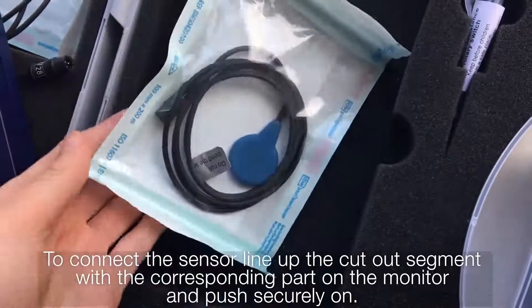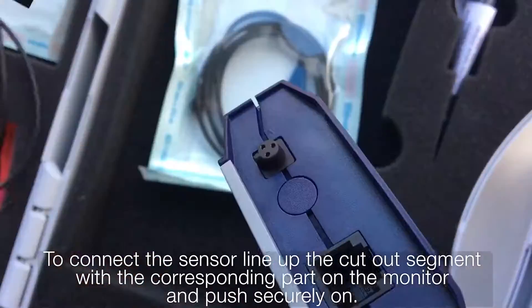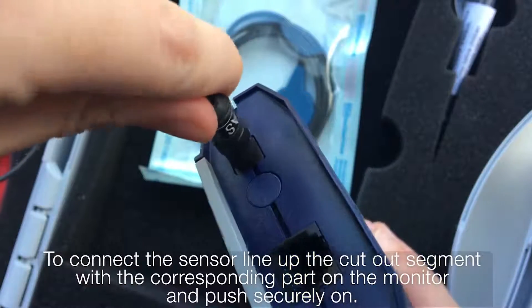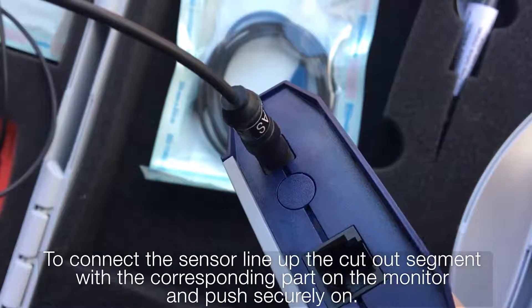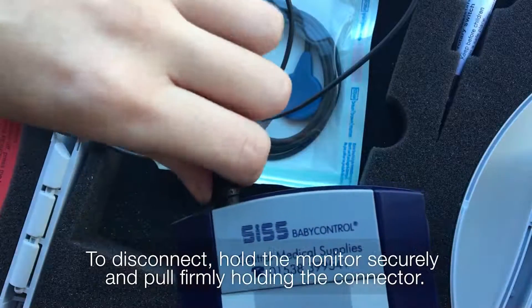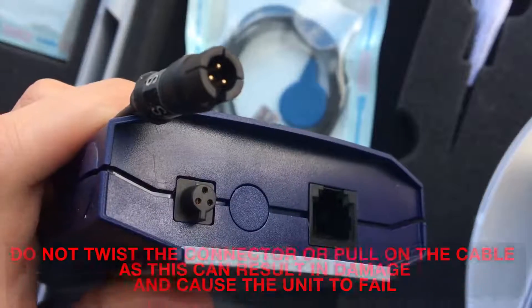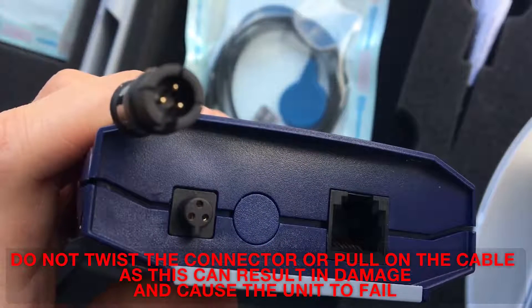To connect the sensor, line up the cutout segment with the corresponding part on the monitor and push securely on. To disconnect, hold the monitor securely and pull firmly holding the connector. Do not twist the connector or pull on the cable as this can result in damage and cause the unit to fail.